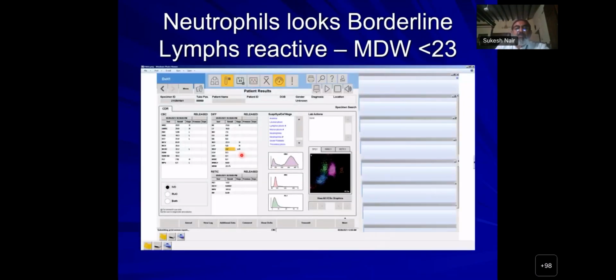I run it on another cell counter, which I have. Again, what I look at, neutrophil looks at a normal size. There are eosinophils. There is no eosinopenia. There is a merger between lymphocytes and monocytes, which happens in viral infection. In dengue, it almost forms a teardrop shape, which Dr. Anil had told me once. But here you can see it's only purely a lymphocyte monocyte merger, which basically means there are reactive lymphocytes, and this is a viral infection.